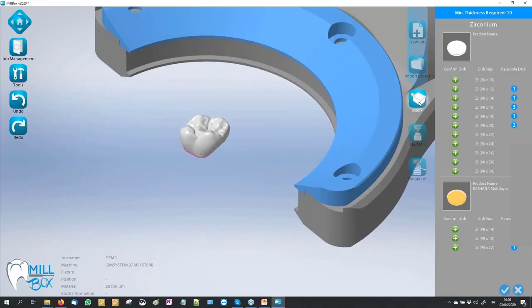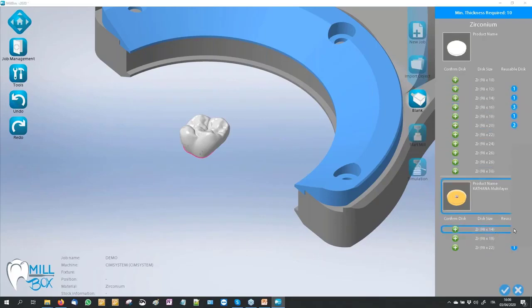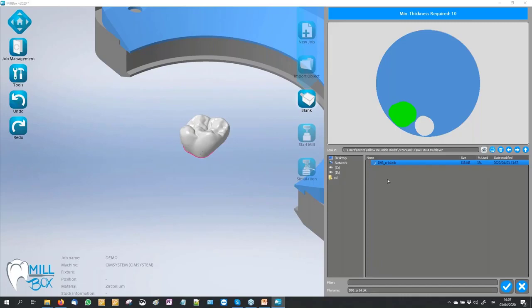We go directly to the next step where we have to select our right stock. In this configuration it's possible to select the standard zirconium material and also in this example the katana multilayer. The software shows us the number of user stocks we have in our archive. I go to select my 14mm thickness stock. In automatic, the software selects the most-used stock in our list — very helpful to find very fast the most-used stock to finish it.